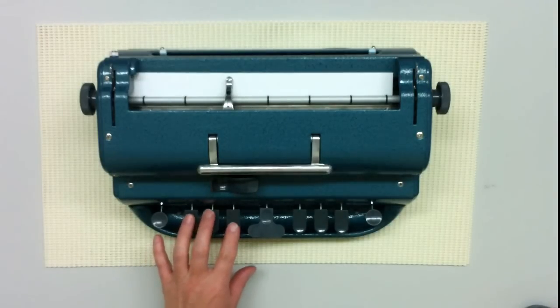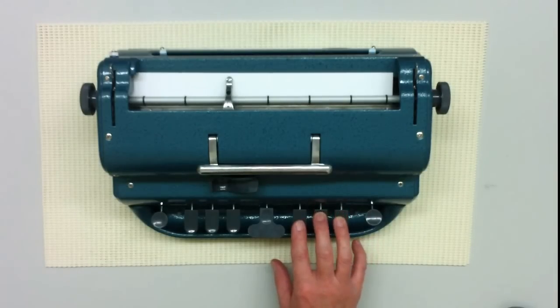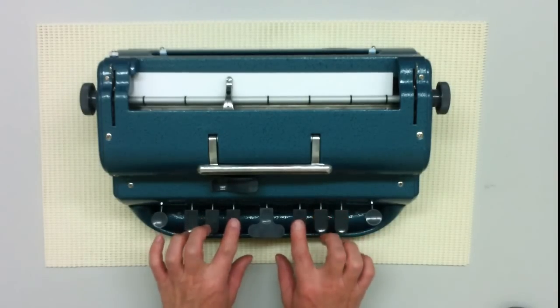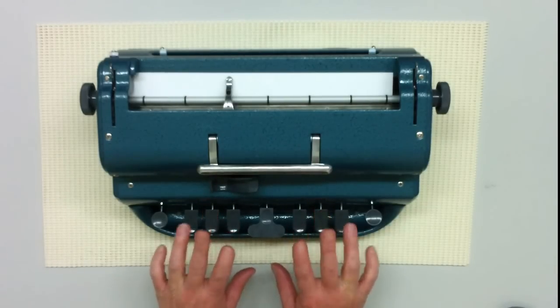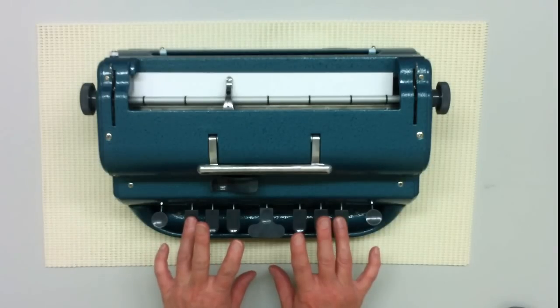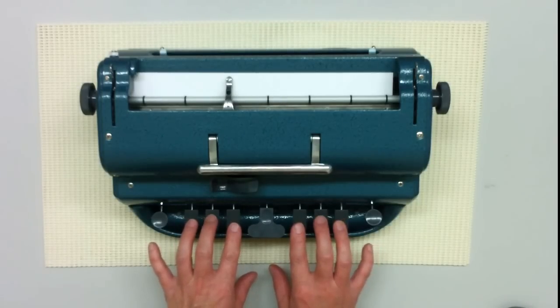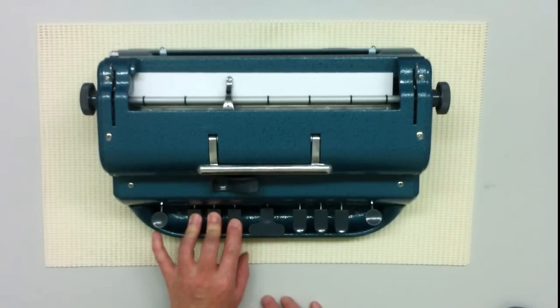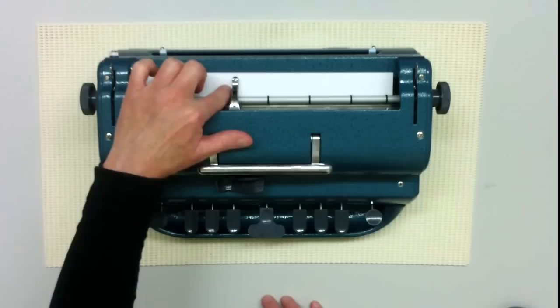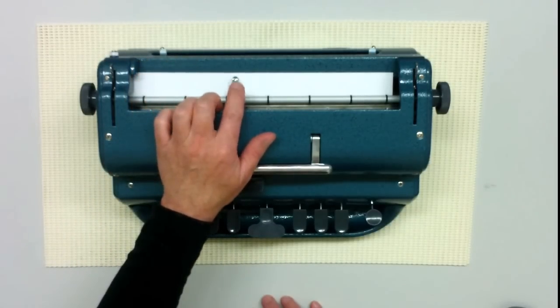When we're writing the Braille, the keys on our left hand produce the dots on the left hand side of the cell, and the keys on our right hand make the dots on the right hand side of the cell. Top of the cell with the pointers, middle of the cell with the middles, and bottom of the cell with the ring fingers. To write Braille, press a combination of keys at the same time. For example, all dots on the left hand, which is dots 1, 2 and 3, make an L. The L is produced at the cursor, and then the cursor moves automatically to the next cell.